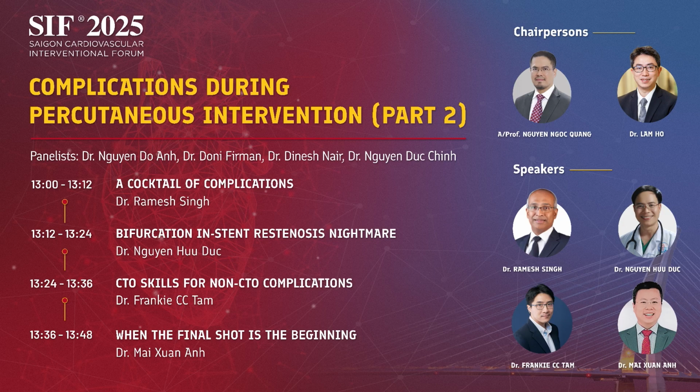Even with ischemia on the PET, it's still borderline. Maybe the EF would stay the same even after revascularization because it's a CTO. So I would say this indication is quite soft, and what is more important is that because the indication is not that strong, if complications happen, then you have to do something more to defend yourself. Yeah.